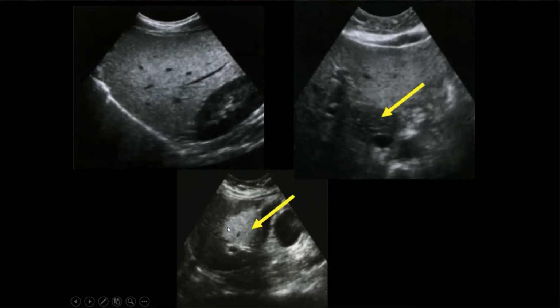It's not like a nice cystic lesion, not like a nice adenoma where you're going to have a nice boundary. It's got this kind of wavy boundary. I'm not sure that it's self-contained. So this would be something that I would want somebody else to look at, but this is an area of focal fatty infiltrate in an otherwise normal liver, whereas this is an area of fat sparing in an otherwise fat infiltrated liver.